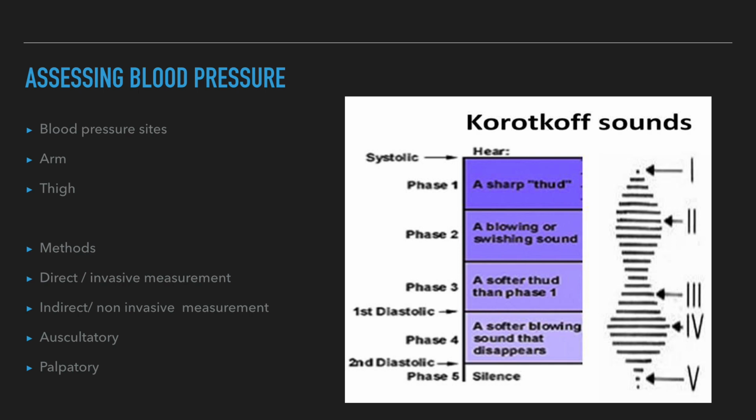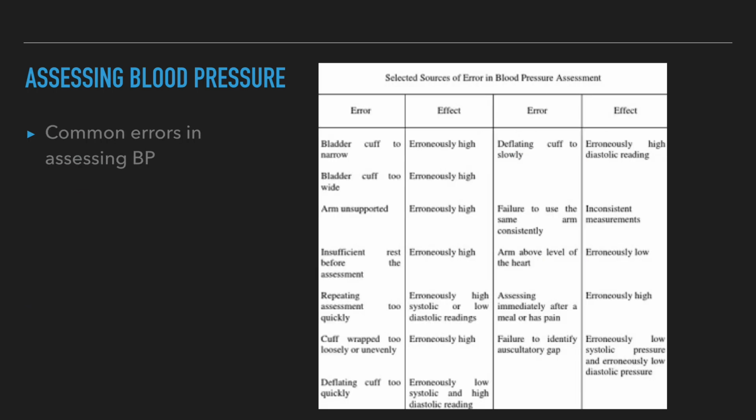When you detect an auscultatory gap, record the systolic and diastolic pressures as usual, and note the magnitude and range of the auscultatory gap, like 196/90, auscultatory gap from 184 to 150. The table summarizes potential sources of error in blood pressure measurement.